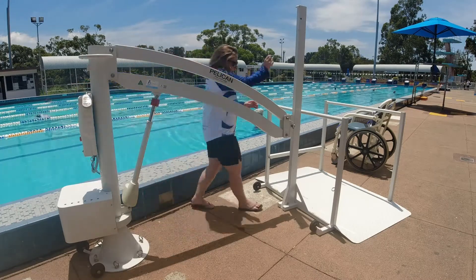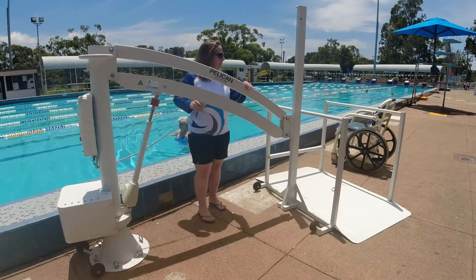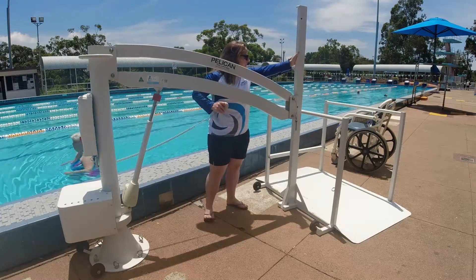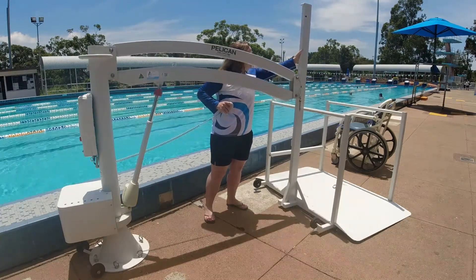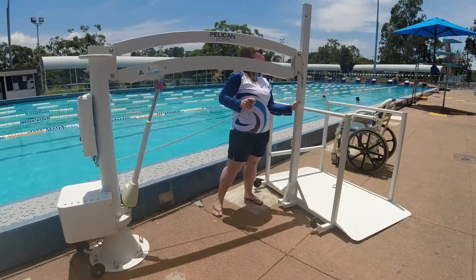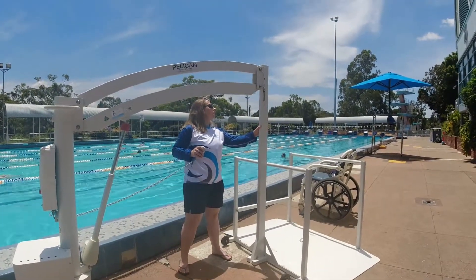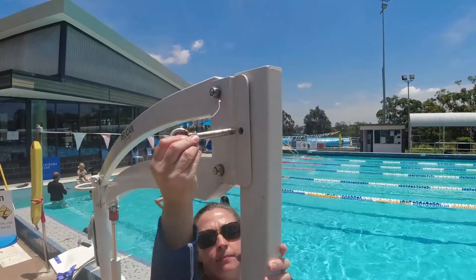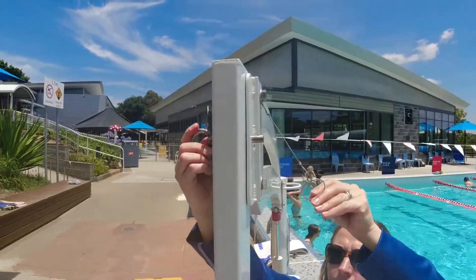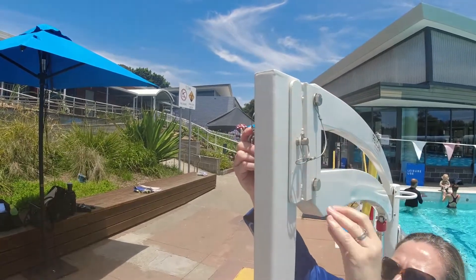To attach the platform, line up the Pelican hoist arm with the platform upright using the left and right handset buttons, then use the up handset button to raise the arm. You may need to apply some guided pressure to the platform upright as it aligns through the arm coupling. Stop when the platform upright hook attaches to the arm coupling, then insert the holding rod from one side to the other and attach the safety pin. This is all a must-do for safety.